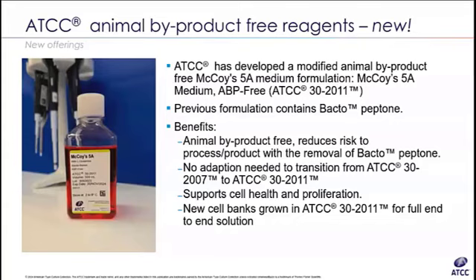It'll look like CRL123. If you see CRL123.NM, it means new McCoy's. So if you see that .NM, it's been made in the new McCoy's. If there is no .NM, that means it was likely made in the old McCoy's or a completely different media that's not McCoy's. All right, good answer, good answer.